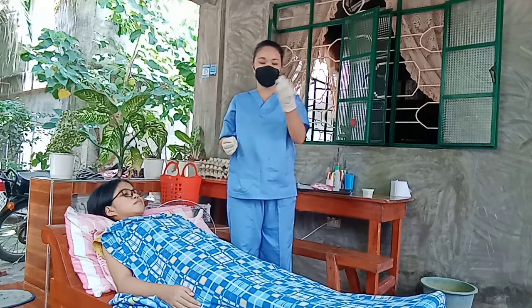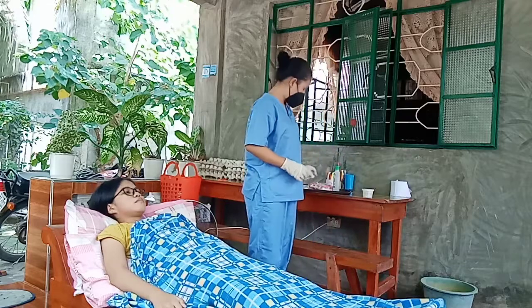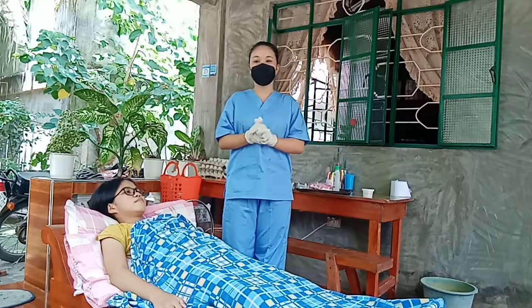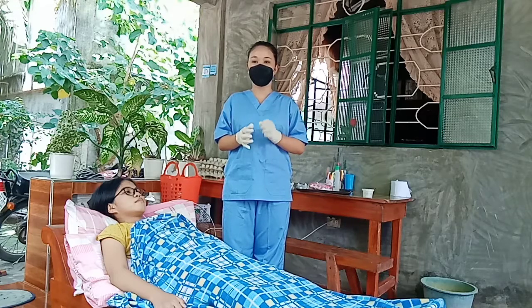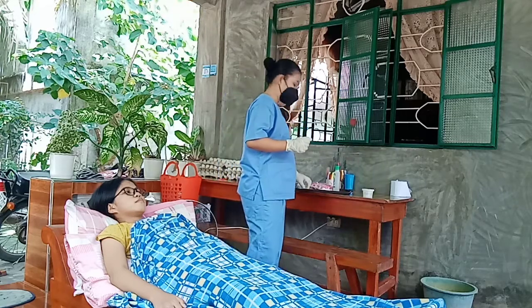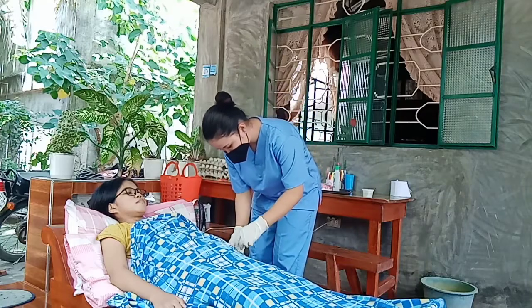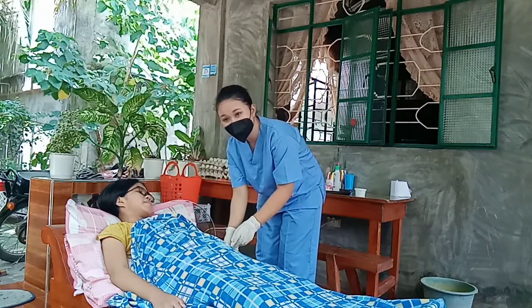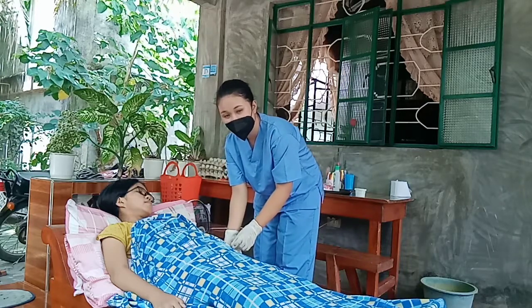Dispose it to the proper receptacle. The next is attach the needleless Luer-lock syringe to the port appropriately. So, attach. The next is withdraw appropriate amount for culture or urinalysis.